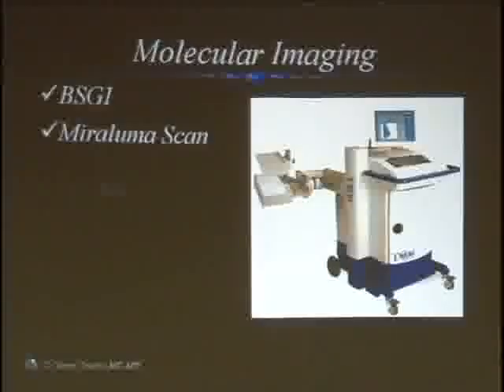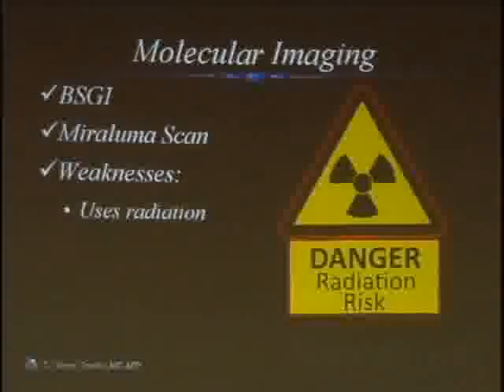So let's talk about the weaknesses. Here I've told you it's all this great stuff. Number one, it uses radiation. As a matter of fact, it uses considerably more radiation than a mammogram. Considerably more. It's the equivalent of 12 mammograms to the breast. It also has a high radiation dose to the heart and other organs, but when it's used appropriately, the risk-benefit ratio is appropriate. Limited availability. That's the big kicker.